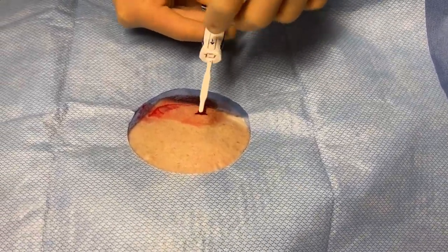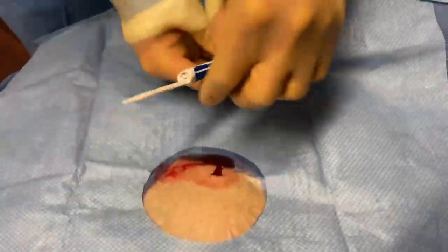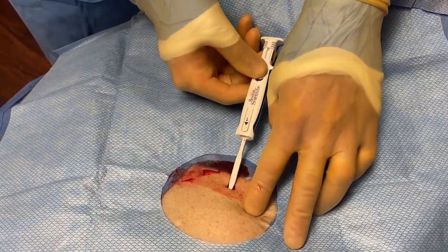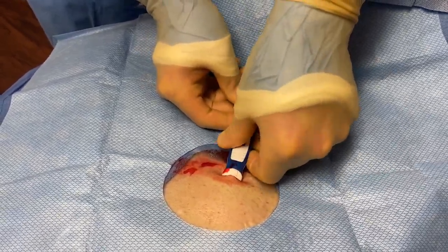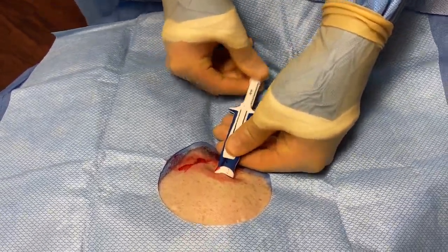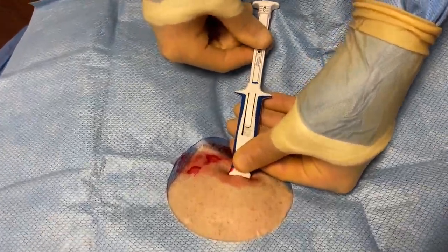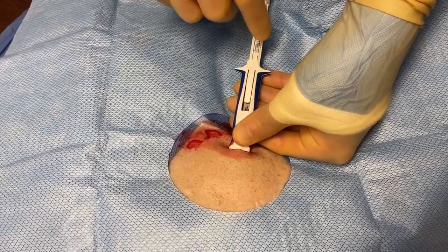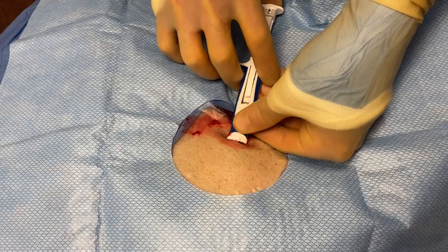With the Boston Scientific device, having the hub up and the lower aspect facing down, we advance the insertion tool and rotate the device. Now we're going to withdraw the needle and watch the loop recorder drop into the barrel.